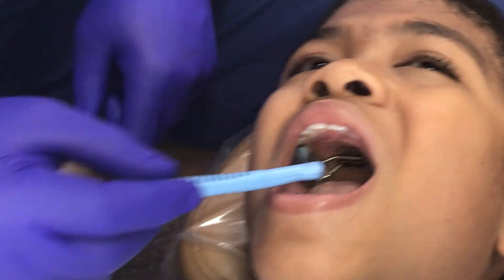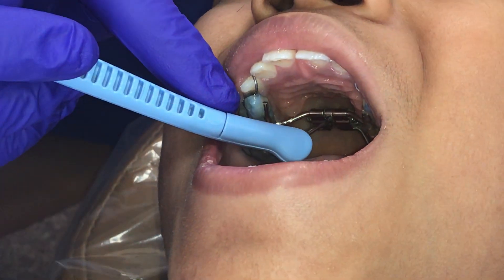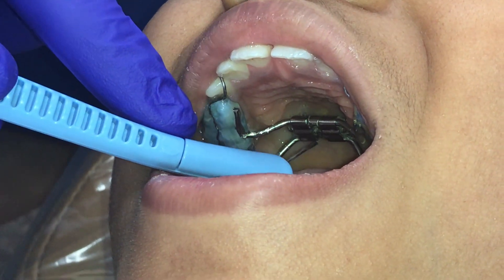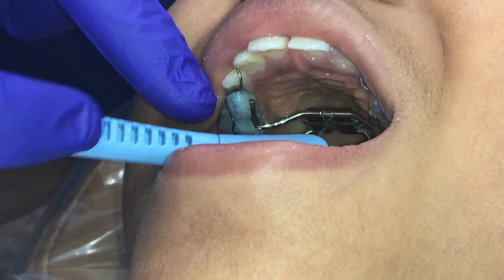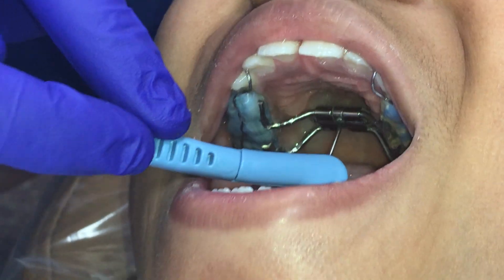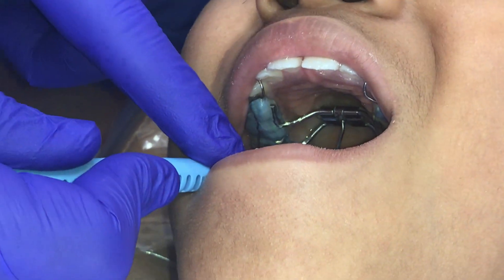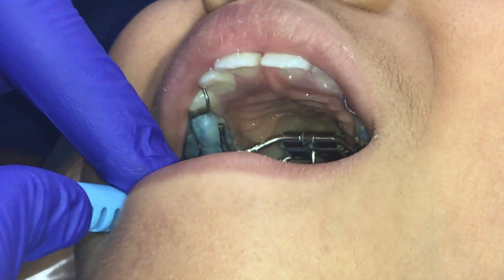Here's your key. Open really wide. You're going to look for this hole right here, insert the key into the hole, and then rotate the key back until you see the next hole.